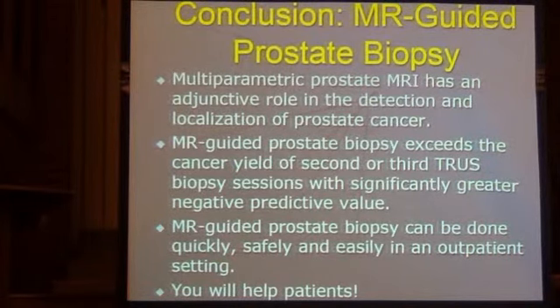Again, this is preliminary. Prostate's a slow-growing cancer. It typically takes 10 years to have any kind of mortality from prostate, but this is where it's moving into focal therapy, whereas if you can target it and you see the danger, go burn it out or freeze it out, or there's HIFU, high intensity focused ultrasound. There are different techniques, but the idea is to get these lesions and preserve the gland so you can avoid the 35% incontinence and 20% sexual dysfunction after radical prostatectomy. So that's the idea of better diagnosis, better staging, and then better biopsies.